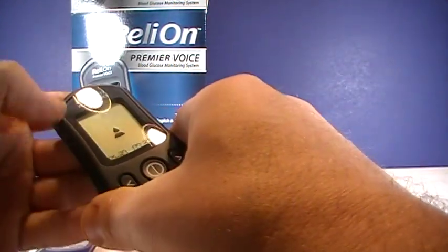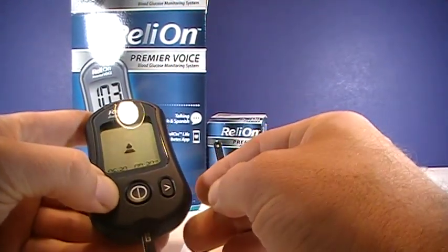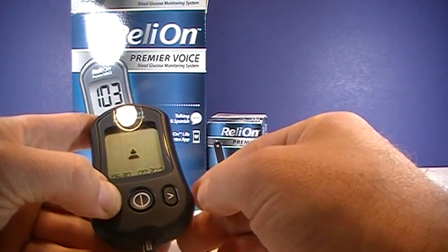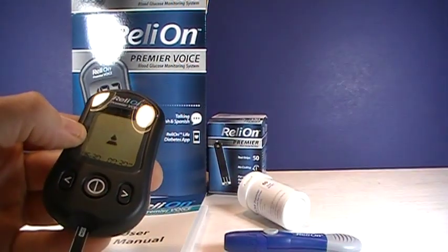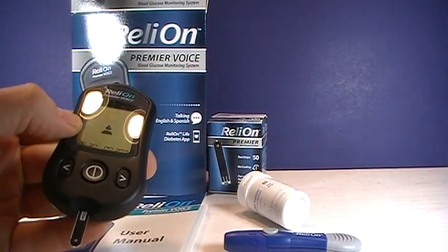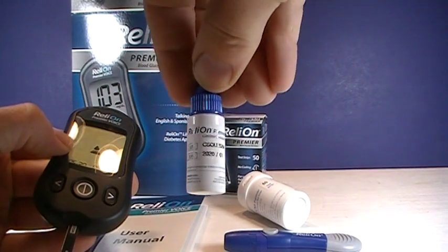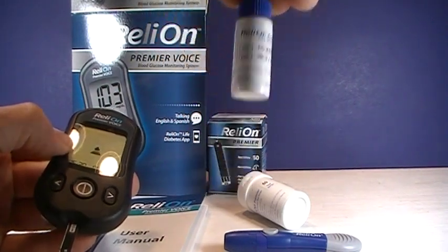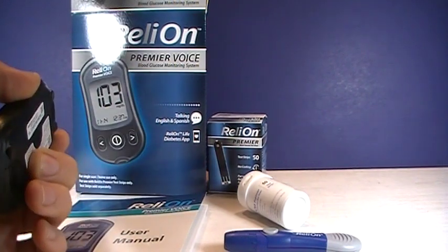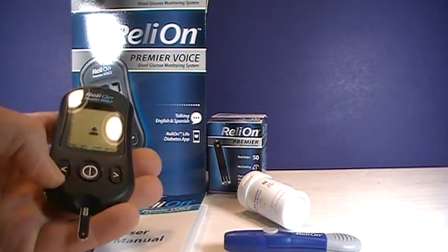It's telling us we're ready. A couple of options here — if you hold the left button, that's for doing a control solution, which you can get directly from the manufacturer. When I got it, there was no charge. You just had to call; there's a number on your test strips or on the back of your meter, and about a week later it showed up in my mailbox.